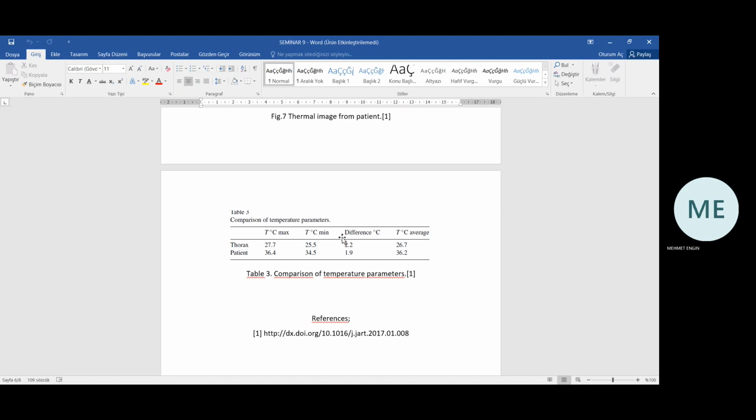In conclusion, thermal images obtained by the simulator managed to show tumor tissue at specific metabolic rates. The model of the simulator is based on an algorithm, and the physical thorax is a dynamic system. For this reason, our thorax simulator is a promising tool for training health professionals in important issues of early detection of breast pathologies. Further simulator proposals should consider also the size of tumors in the algorithms.